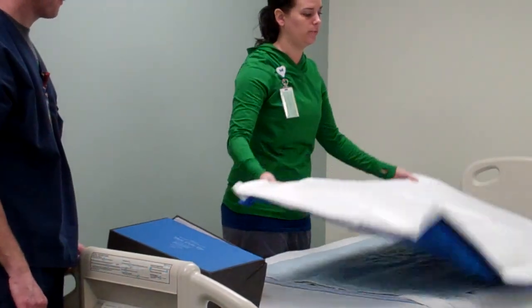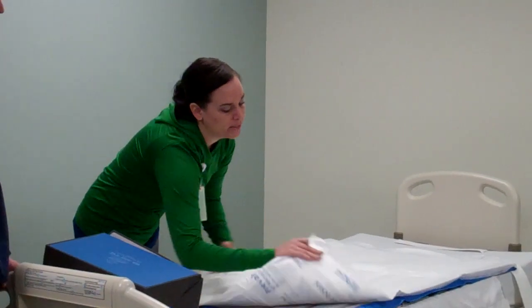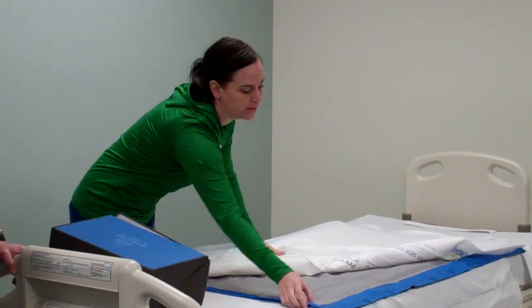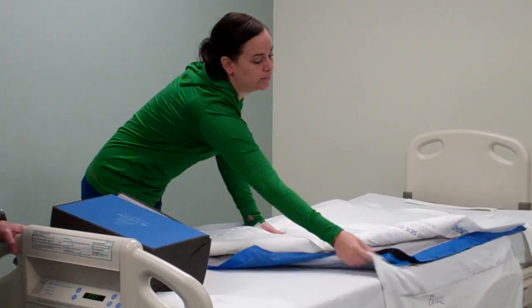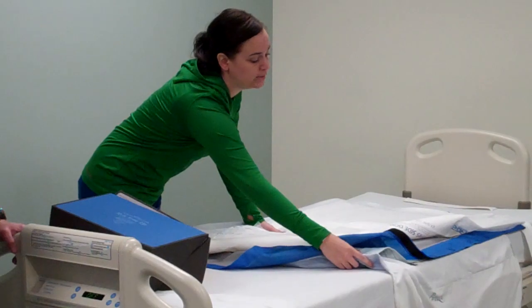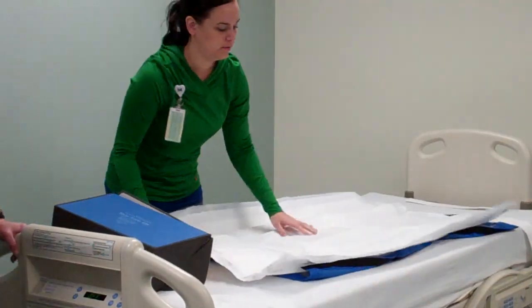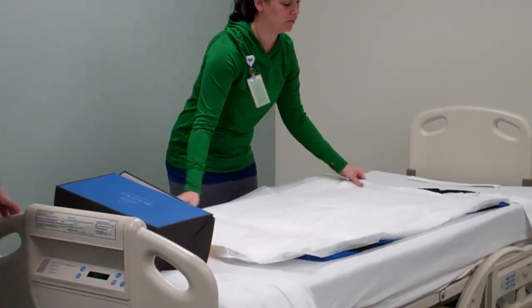This is the regular version — we also have a bariatric version. But as you can see, it's basically the same thing as the Prevalon moon boot things: the felt on the outside and then this nice slippery stuff on the bottom. And that means we can take all this off on the bottom, get rid of that.